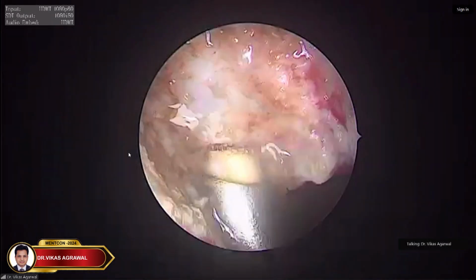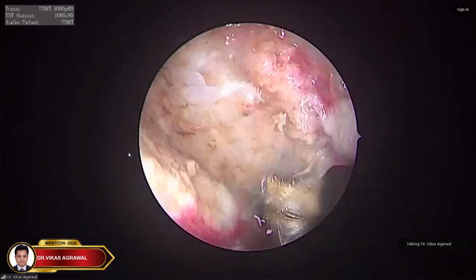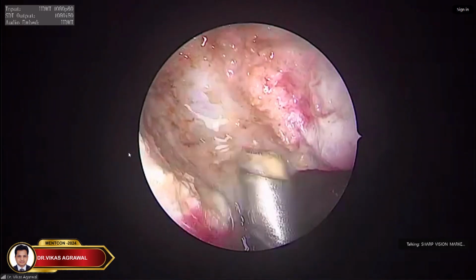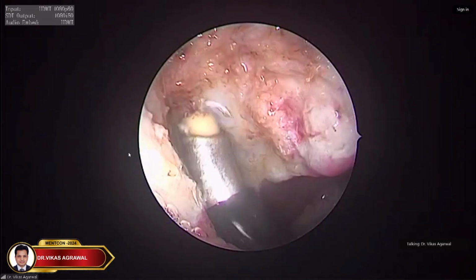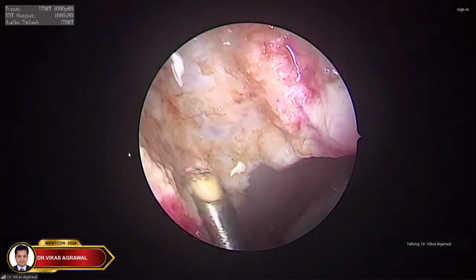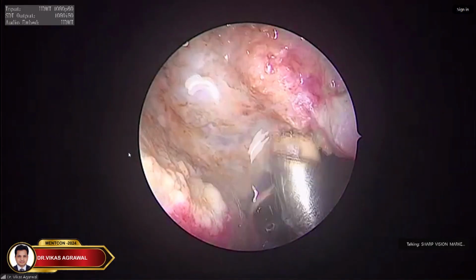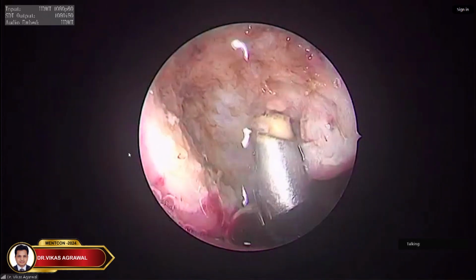It's very difficult for a parent to understand why a surgery has to be done again, or why the results have not been good. And you see how nicely you can see the fascia in every single case. Absolutely. It's a natural boundary. Unfortunately, it was not described earlier. Now the right side dissection is complete.